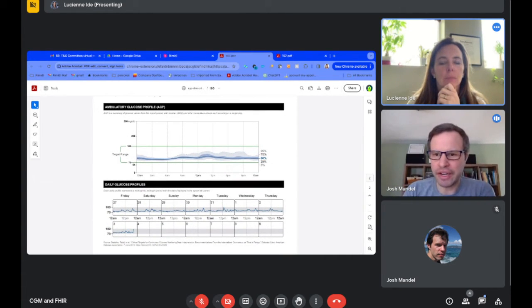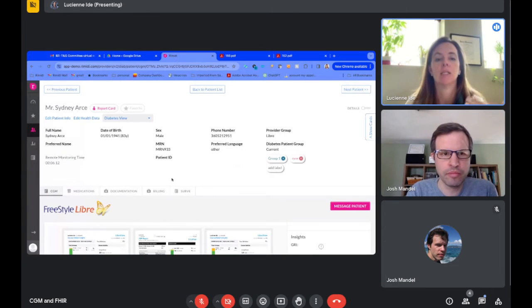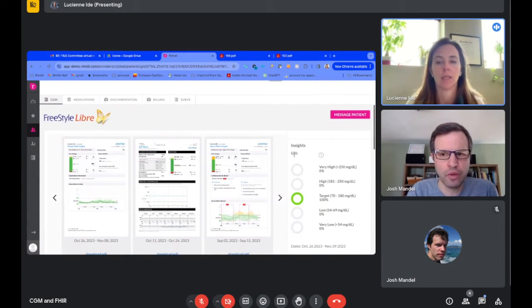And so if I decided to use the results of some Stanford study for characterizing patients, maybe healthy patients, based on their glucose spike patterns in CGM, I just couldn't do that based on the APIs that are available from the vendors today. Not from Abbott. Dexcom does, in their standard partner API, give access to timestamp data. So, actual reading and time. And so with them, we receive that data. We'll actually graph that data in addition to showing the standard report and the insights.